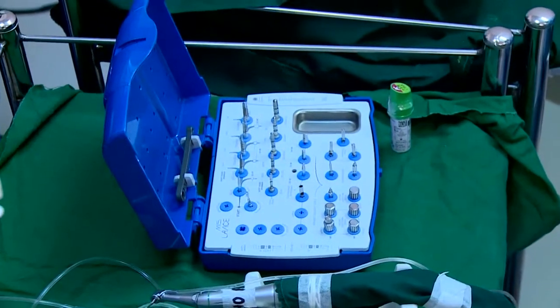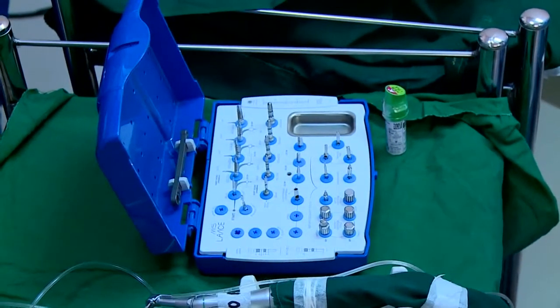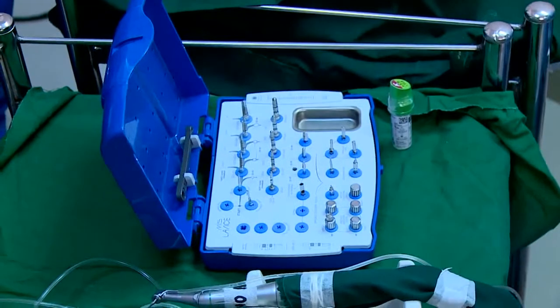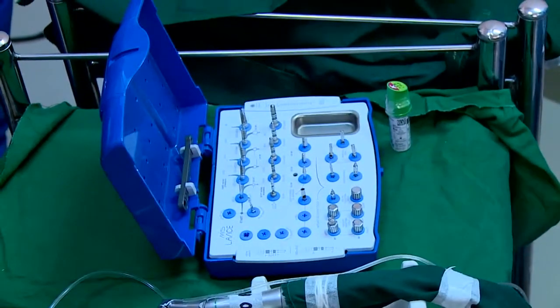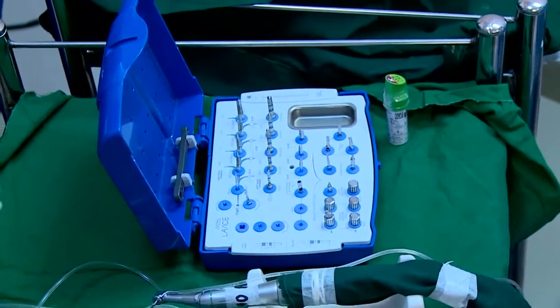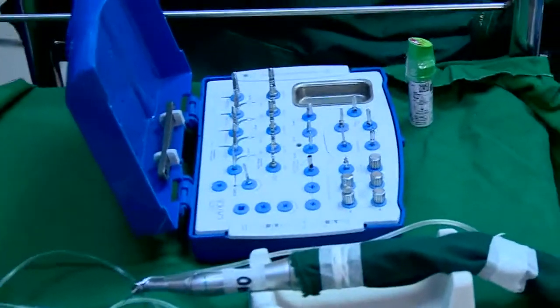Because the most important thing about implant osteotomy site preparation is the temperature of the bone, the core temperature of the bone. We have to make sure that it does not exceed 47 degrees for any given minute, because after that the bone regeneration you can get is minimal or non-existent. So your implant is not going to osseointegrate. It's a screw at the end of the day, but this screw will not come out after it integrates with bone. That's one of the main things we have to say.